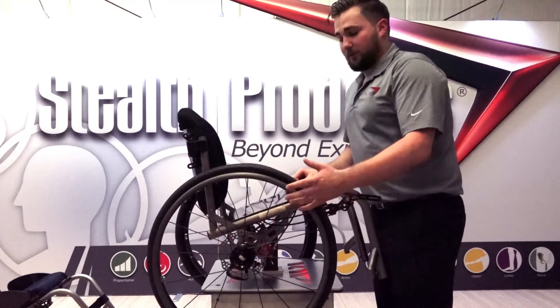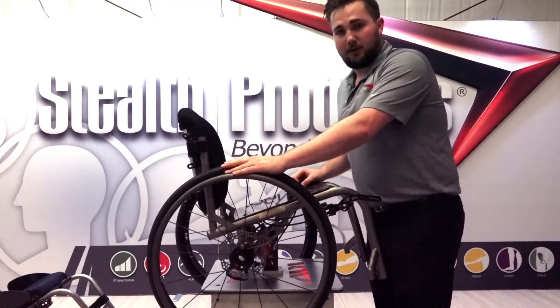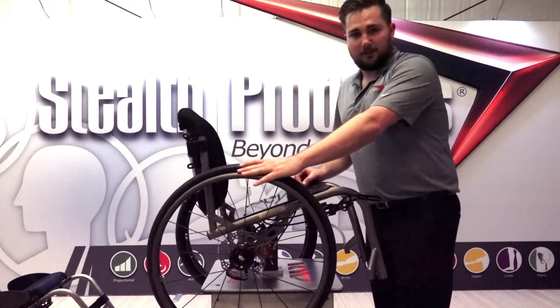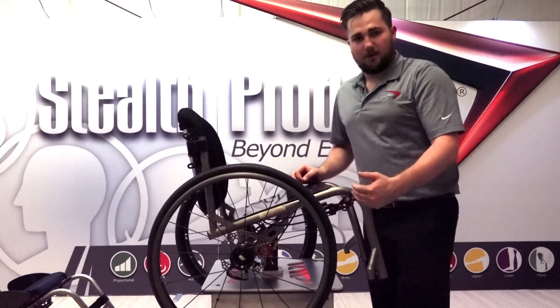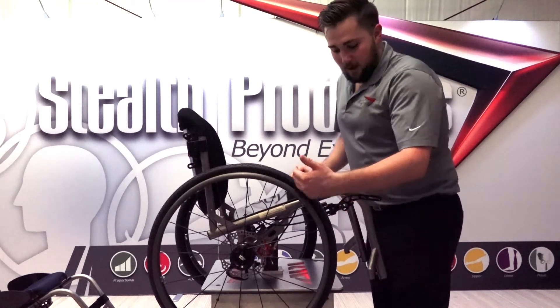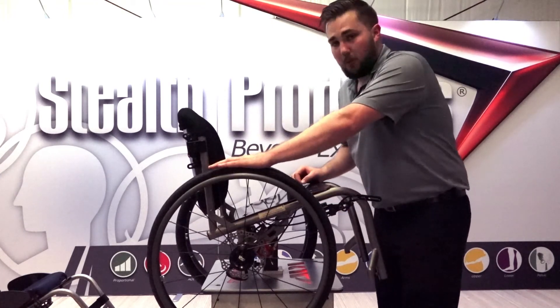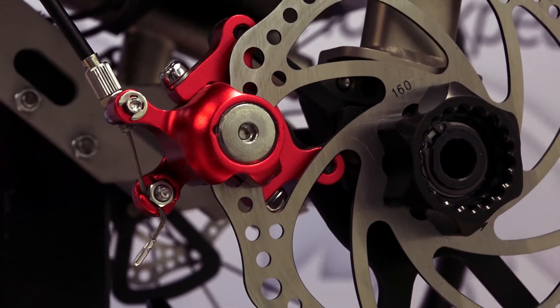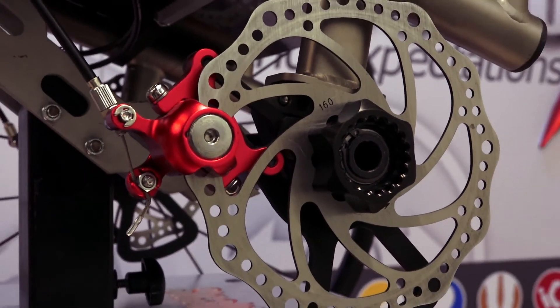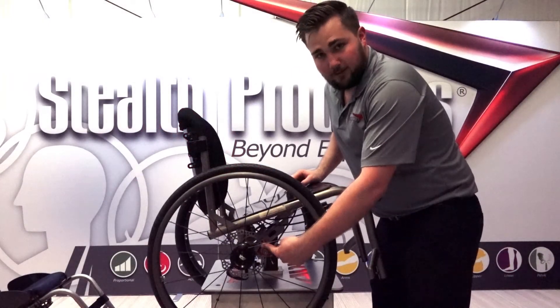We can change out our wheels easily. For instance, if we're using everyday wheels throughout the week and then on the weekend we want to go to the lake and put on knobbies, we can make that change quickly without needing to adjust the locks. Also, as our tires get wet or wear down over time, we won't have to continually adjust these locks — it's always braking from that same consistent spot on the disc.